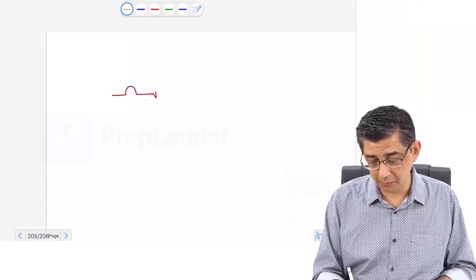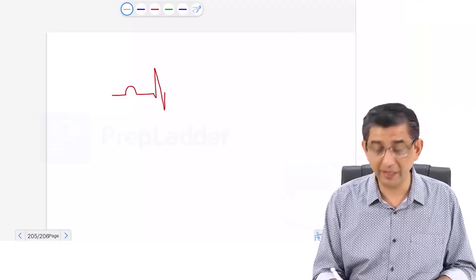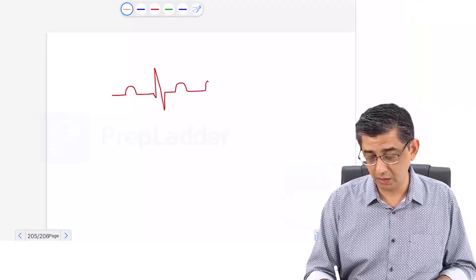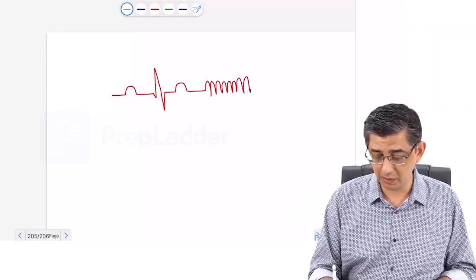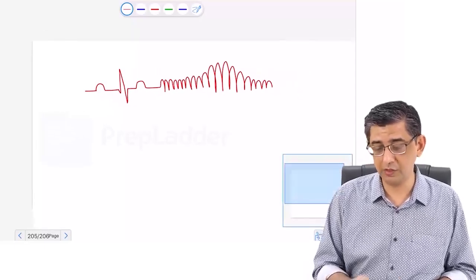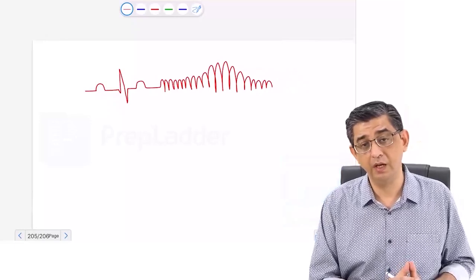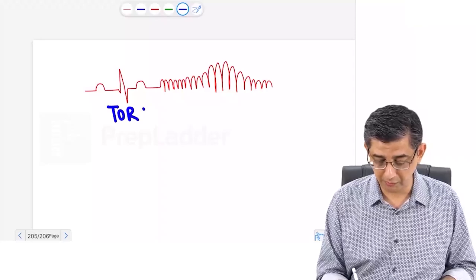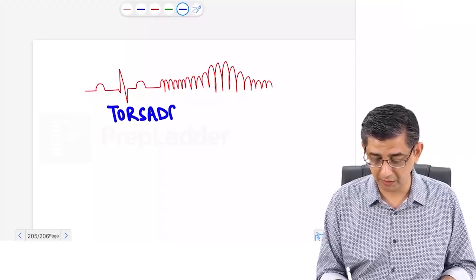This time I'm describing a patient with an electrolyte imbalance. Now, what kind of electrolyte imbalance? I will tell you in a while. At the moment, all I'm saying is that if you get an ECG of a sinusoidal pattern, and if you're noticing that the height and amplitude per se of these QRS complexes is varying, the way I have drawn it, this makes it relatively easier for you to comprehend why they call it polymorphic ventricular tachycardia.